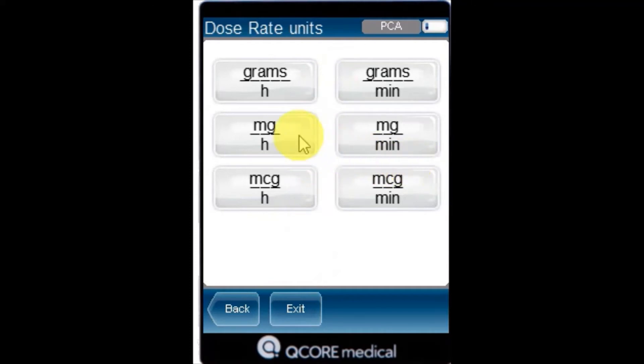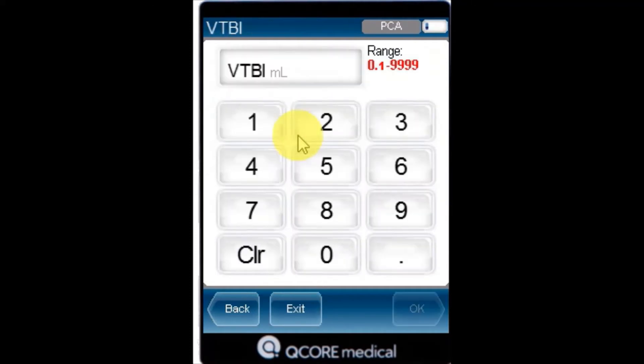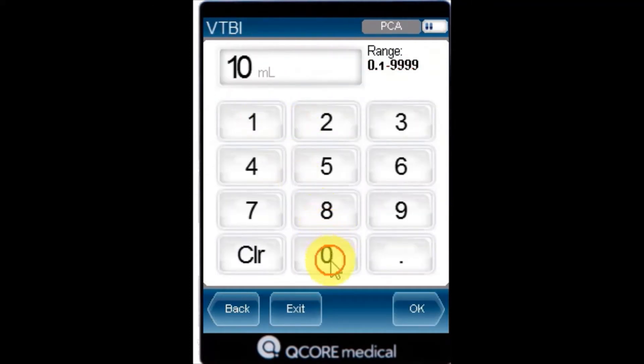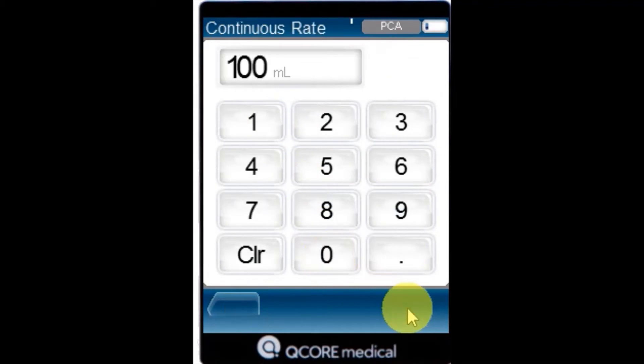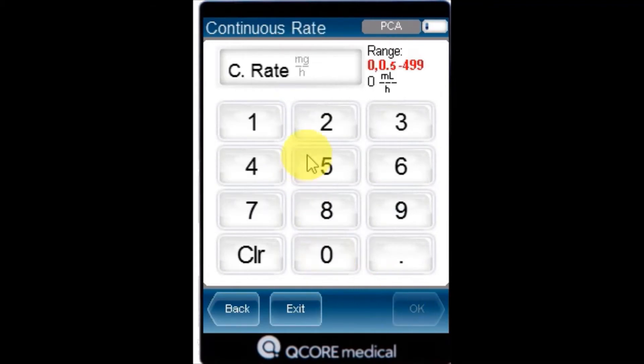Using the keypad, enter the VTBI and then press OK. Using the keypad, enter the continuous rate value, then press OK.